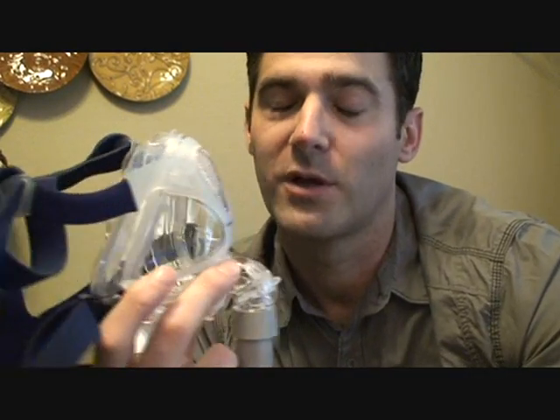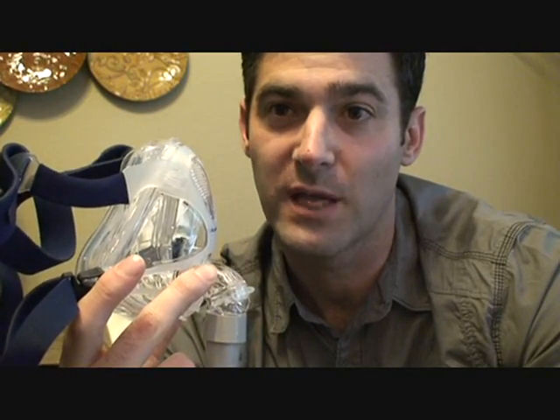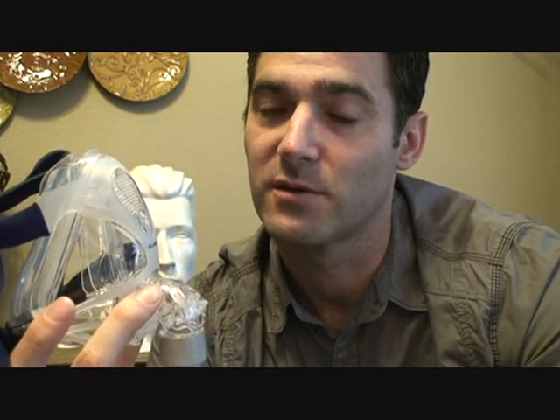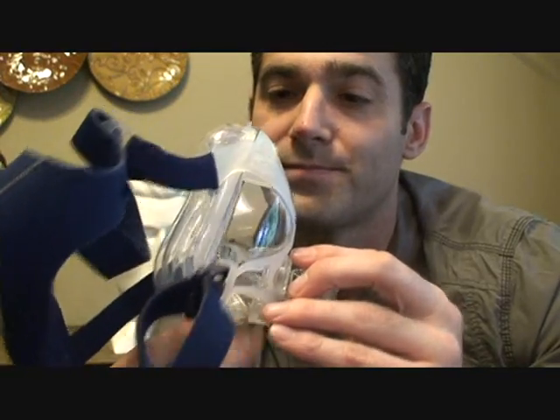My name is Jason, I'm a registered sleep technician, and I wanted to show you the ResMed Quattro FX full face mask. This is fairly new as of the taping of this, which is early June of 2011. It's a good mask.